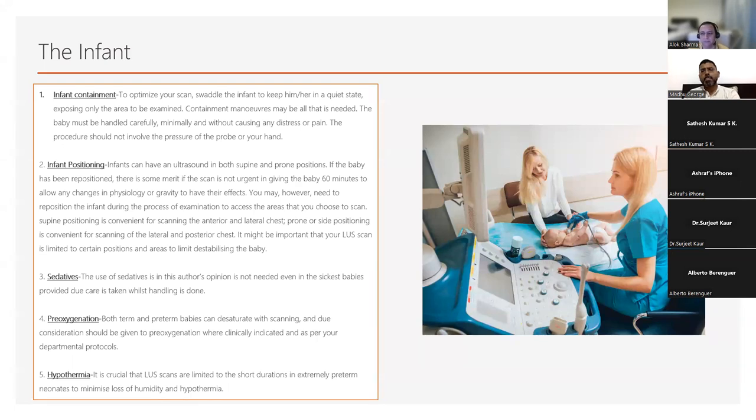In respiratory disorder, admitted to the NICU. Sure. Go on. Amazing. Anybody else? If there is any sudden deterioration of the baby. Beautiful. Maybe on ventilator or on CPAP. Amazing. That's really good. Anybody else? To see whether it's a surfactant baby. Okay. So administration of surfactant, lung ultrasound scores. I had a gentleman say something. Yep. Suspected antenatal problem. Okay. Just to confirm the diagnosis. Yep. So congenital diaphragmatic hernia. And Nadia will talk about cystic lesions as well. Not that they're easy to diagnose.